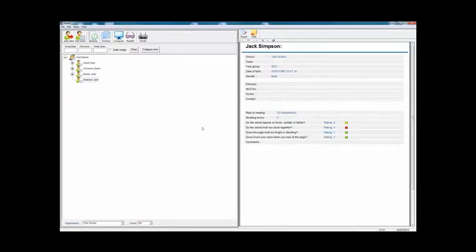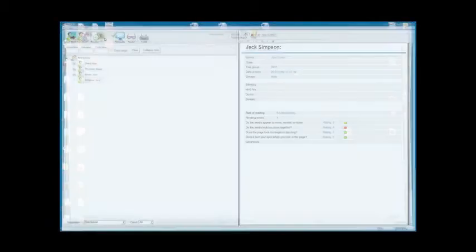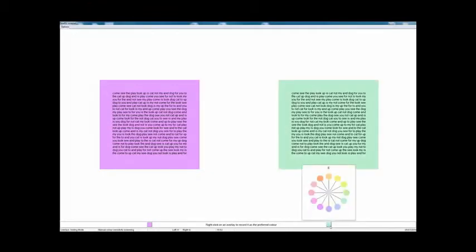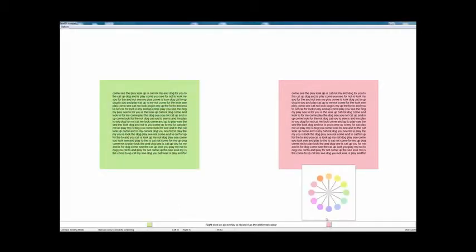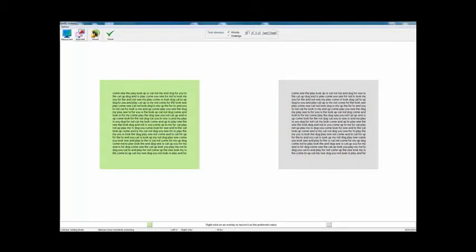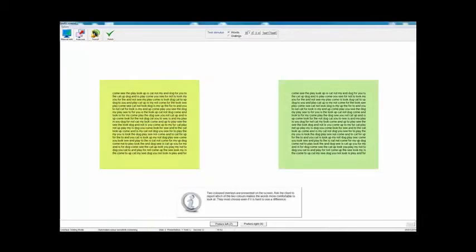The next stage is to see if color is of any benefit. You'd normally start by doing an overlay test. So I've selected overlays. You could do this manually — you can see it's put up two passages of text and you can select any of the ReadEasy colors as a background by just clicking on the little tile at the bottom. If you want to do just a quick test, you can do so, or you can select a gray by clicking in the middle. But of course the beauty of doing it on a computer is that you can automate the process.